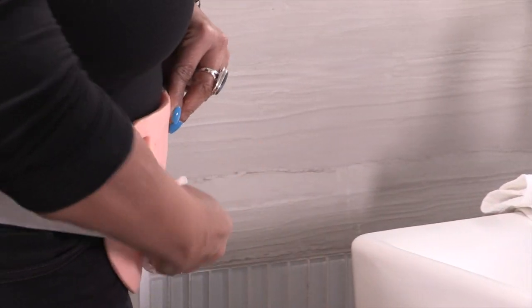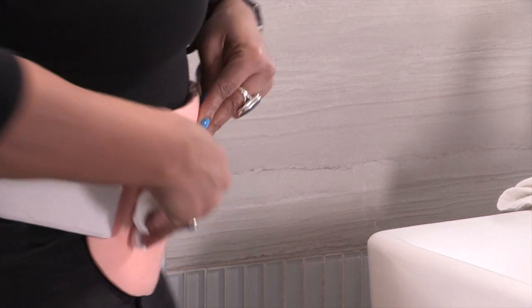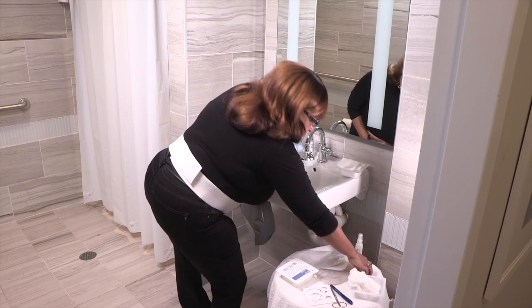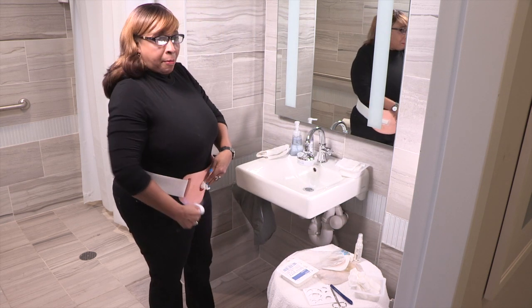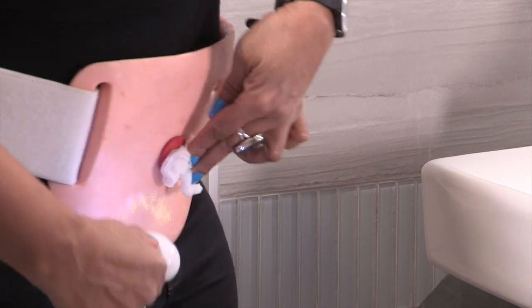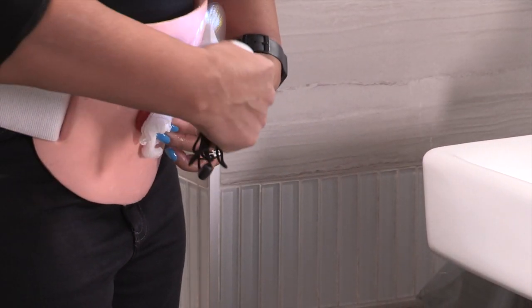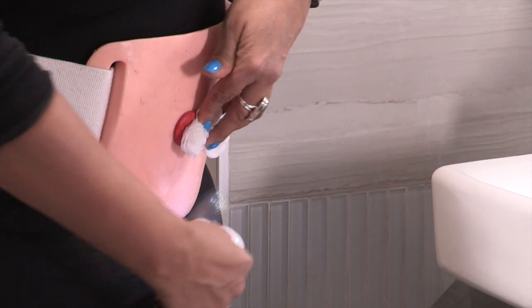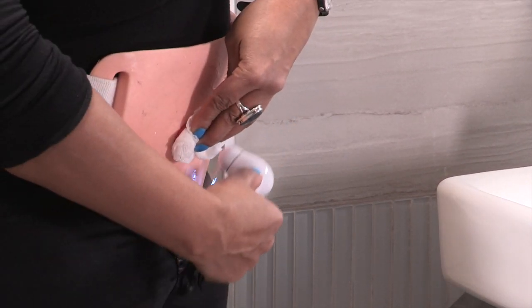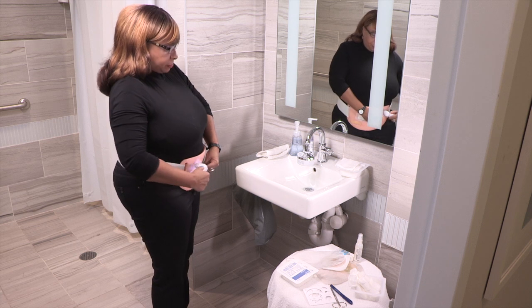Don't use any soap. Dry the skin around your stoma. You can use a blow dryer on the cool setting or a hand-held fan, or you can pat your skin dry with a dry gauze, paper towel, or clean towel. Make sure the area is completely dry — your skin shouldn't be sticky.